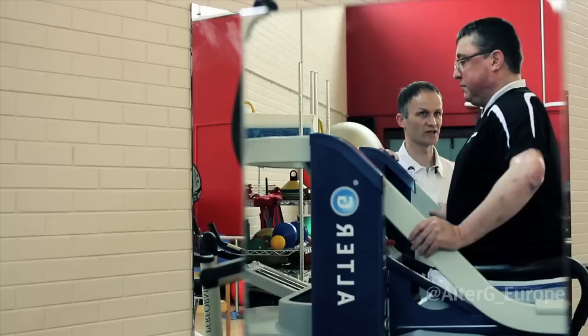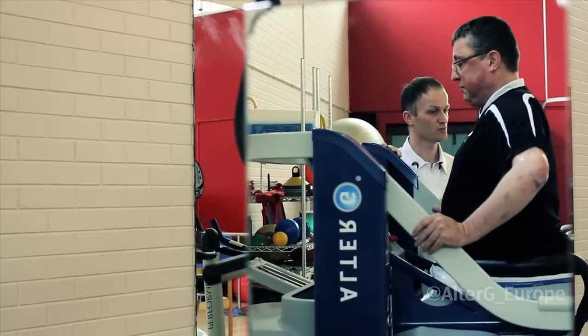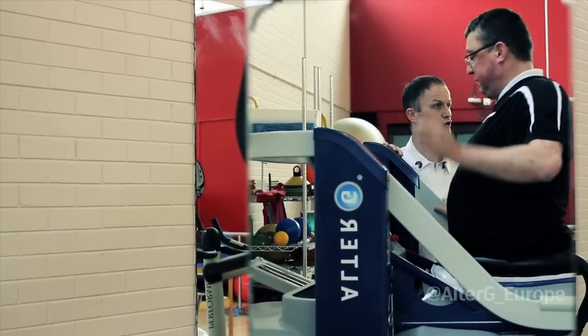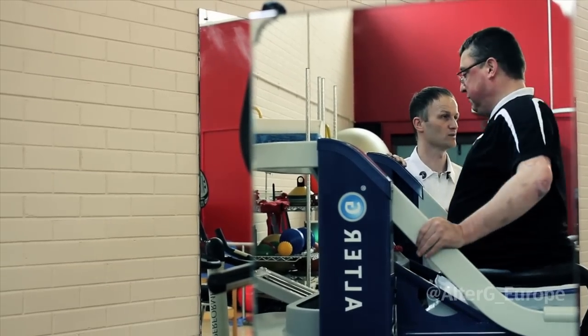He's a young man with family and kids and he wants to be active, but the nature of his conditions would really struggle to allow him to do things which he would deem active enough.